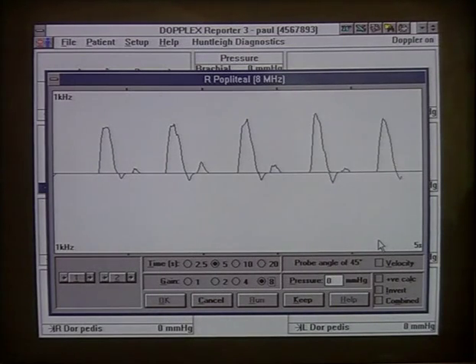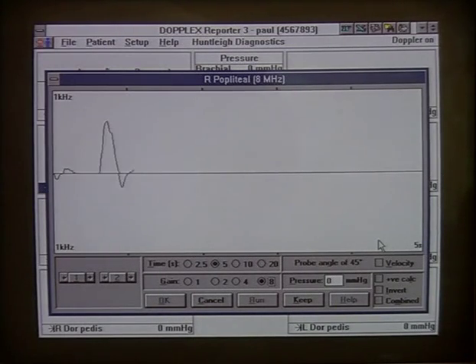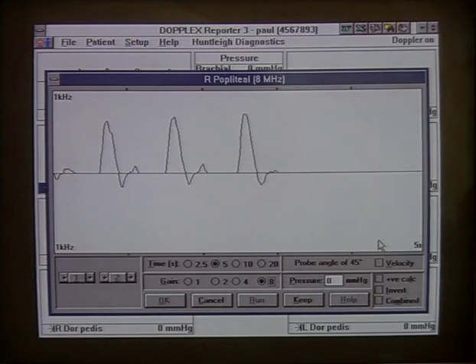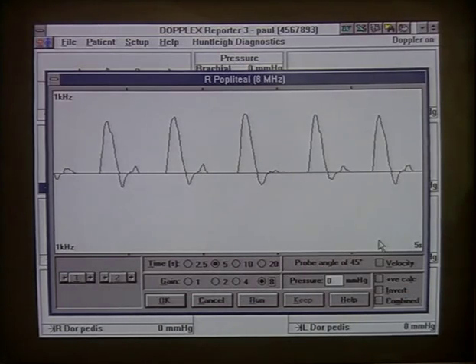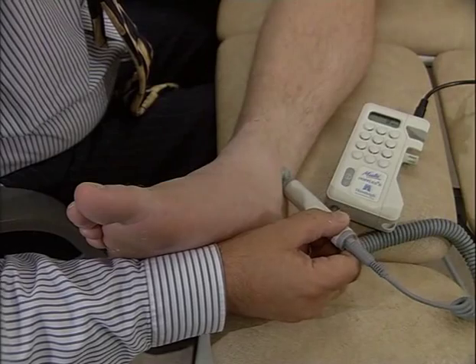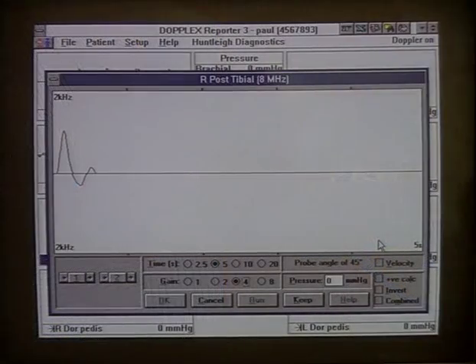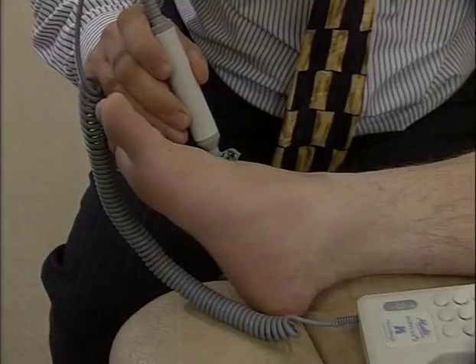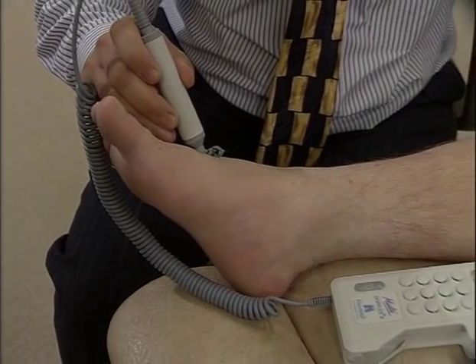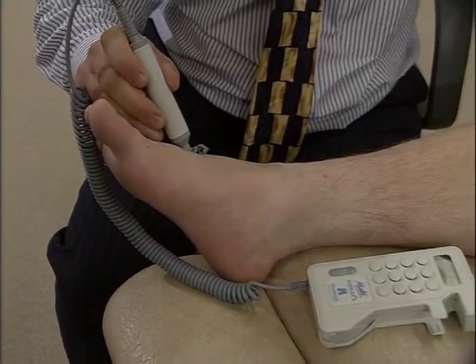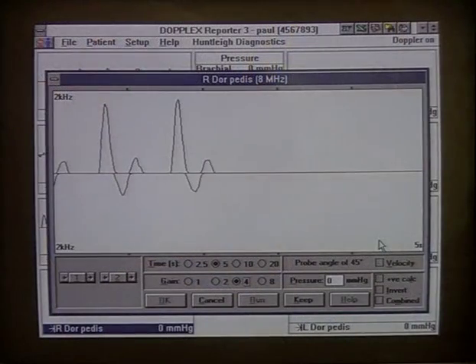The shape of this waveform may also be influenced by arterial disease in these and other surrounding arteries. The posterior tibial also produces a strong triphasic signal. Finally, the dorsalis pedis is located and a strong triphasic signal is found.